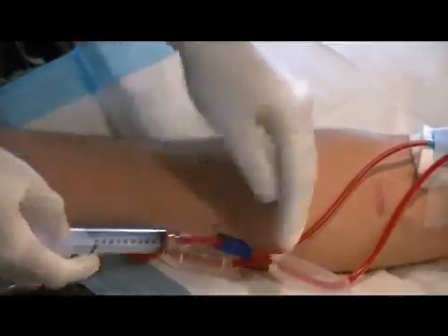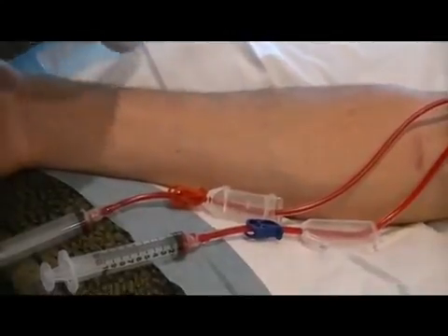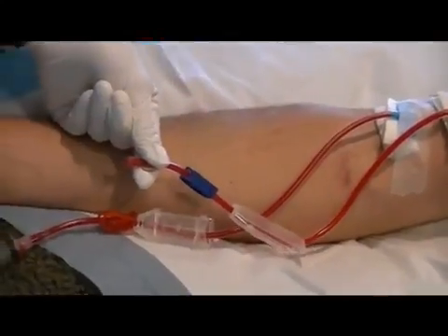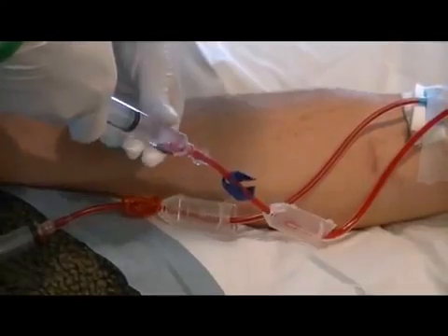That one feels good. You can feel when you're pulling back and pushing it in if you have any resistance, if it's up against the wall. Same thing with the heparin, you pull back a little bit first.